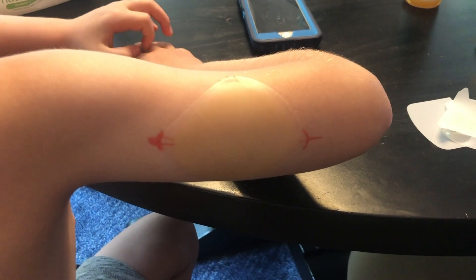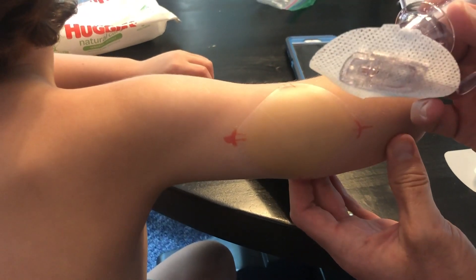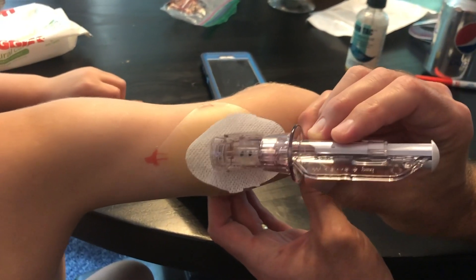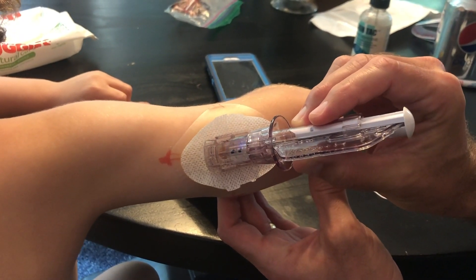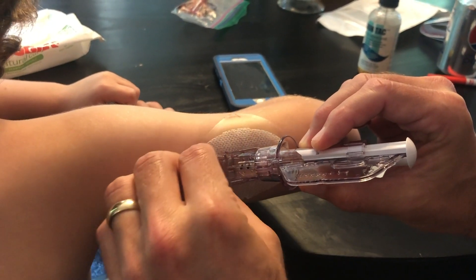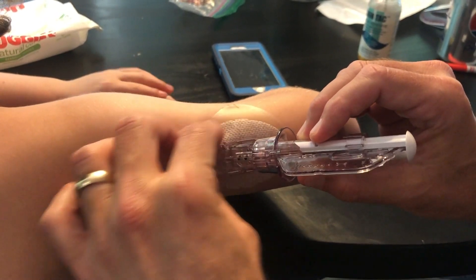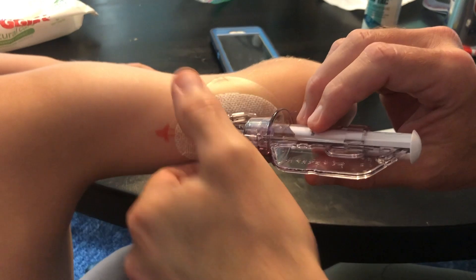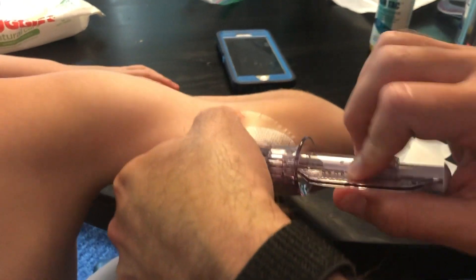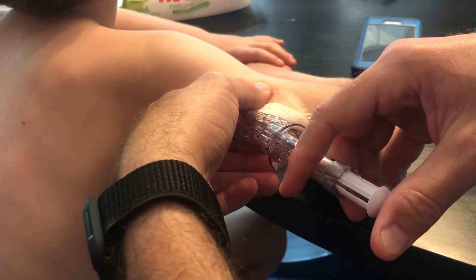Once the alcohol is dry, we take the sensor itself and stick it directly onto the HydroSeal. Make sure it's got good adhesion, then pinch up the skin, remove the safety, pinch up the skin, and inject straight through the HydroSeal.